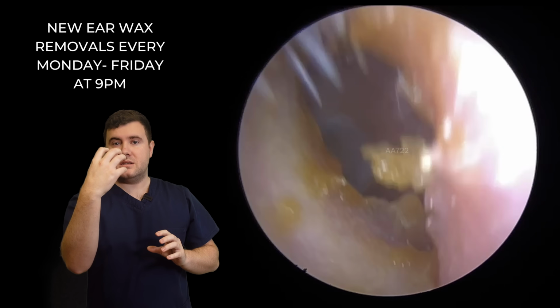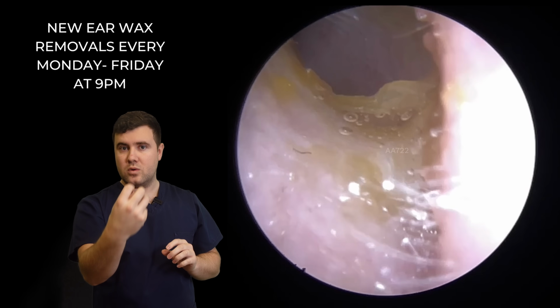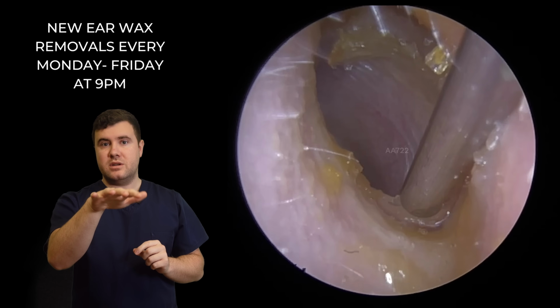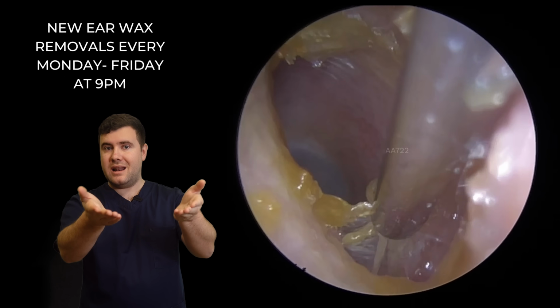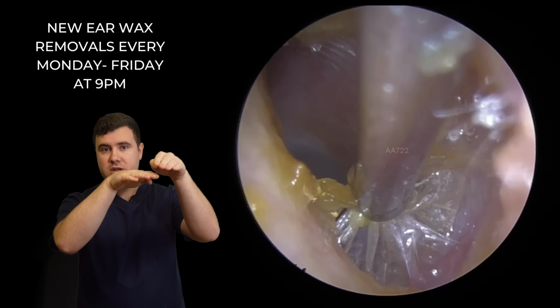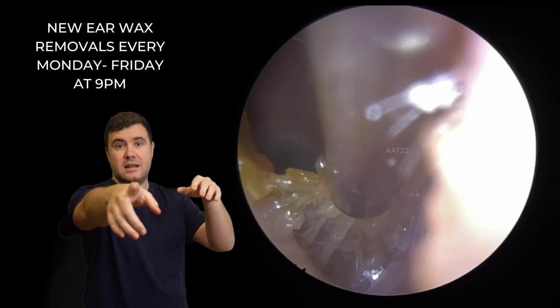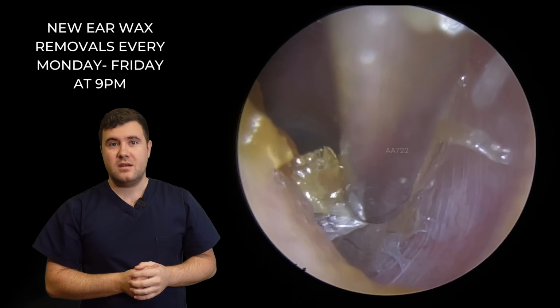So this is putting up a little bit of a fight for us. It's obviously still holding on here. So I've introduced a little bit of olive oil. Now what that's going to do, it's not going to soften the skin, but what it is going to do, as we lift that skin, the oil is just going to continue following where the skin is going down the ear canal. So you can see it's actually coming away a lot easier for us here.